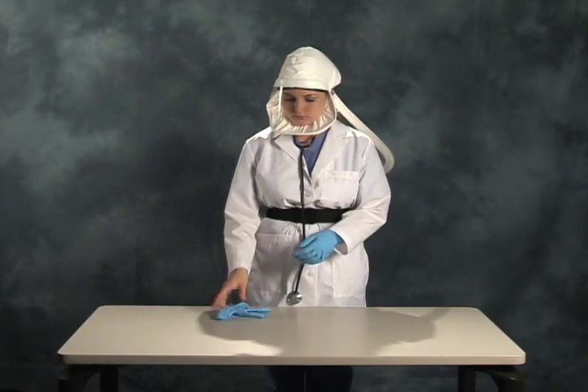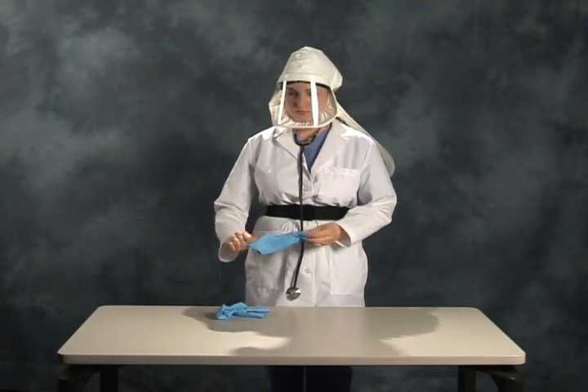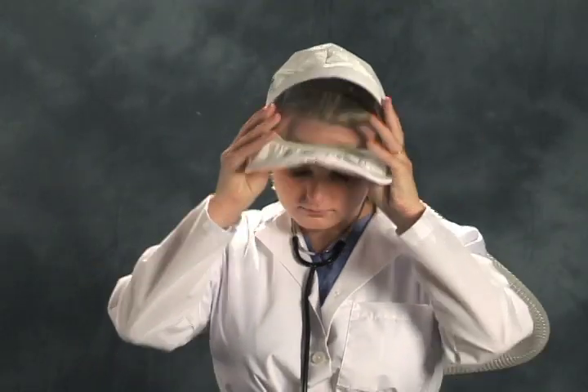We will now review removal of the Sentinel HP. Remove the head cover. Then remove the waist belt and turn off the blower.